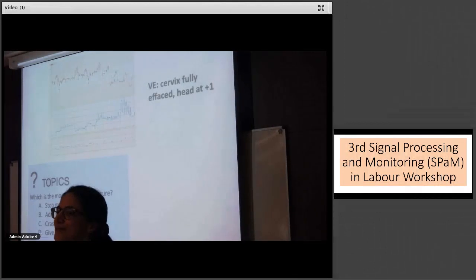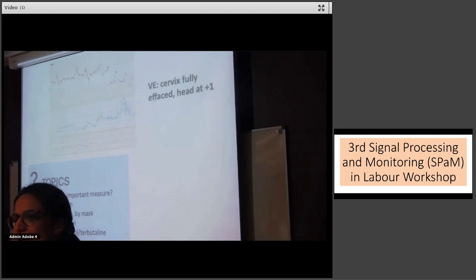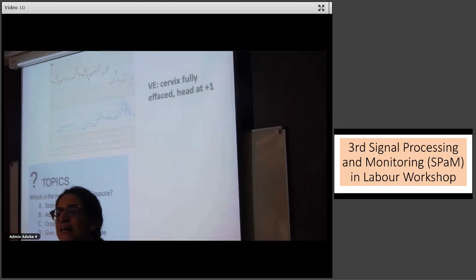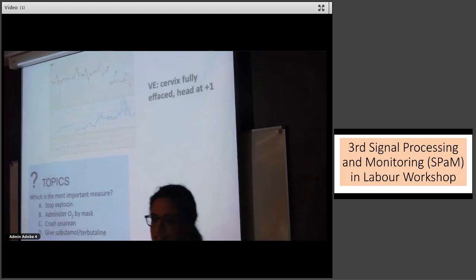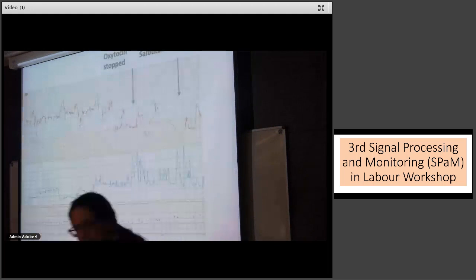We are very short on time. We need to speed up. Two questions, yes or no, quick answer, and we can move on. Is that a first baby? Is it a prima? Second question is, when you say stop pushing, is that physiologically always possible? Yes or no? There are situations where women can't stop. It is normally when you have an epidural on, which is 90% of the cases in Portugal. Can I just say that it's not possible to answer clinical questions by yes or no.